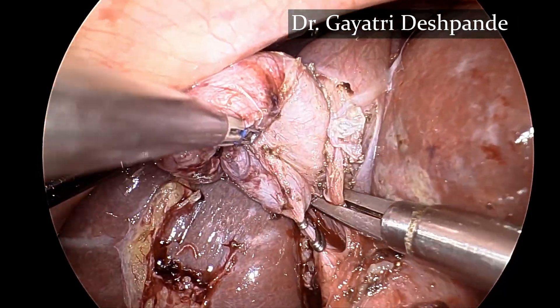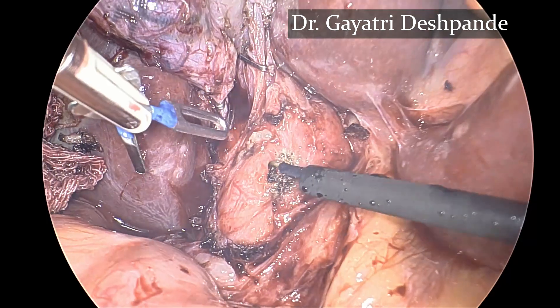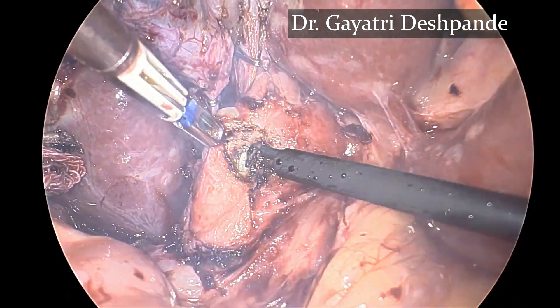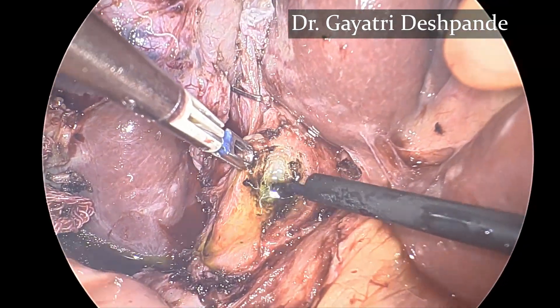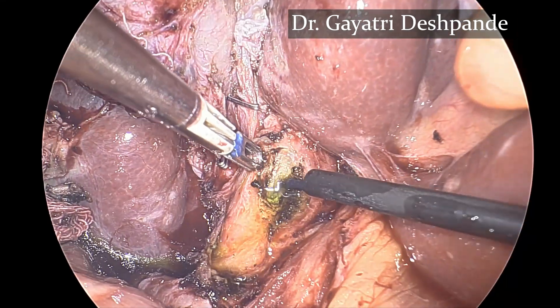The cystic artery is also clipped. The common bile duct is now opened using a monopolar rotary hook, and the opening is extended further on the common bile duct side.